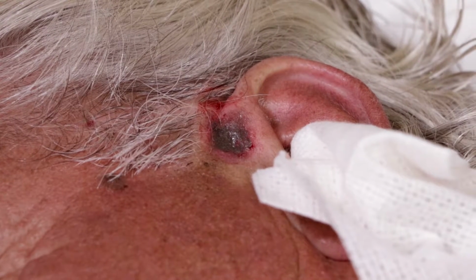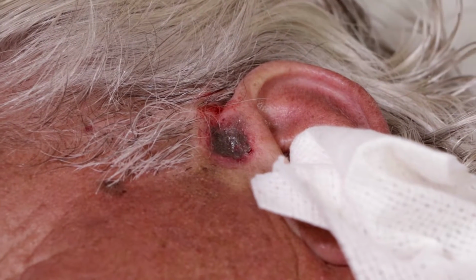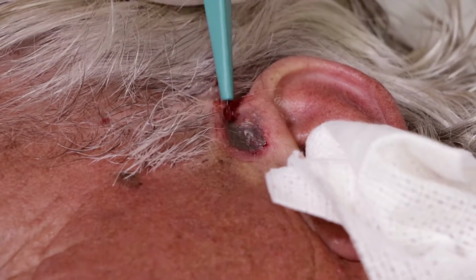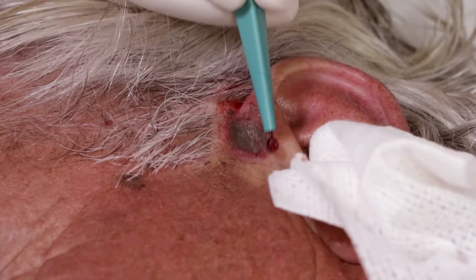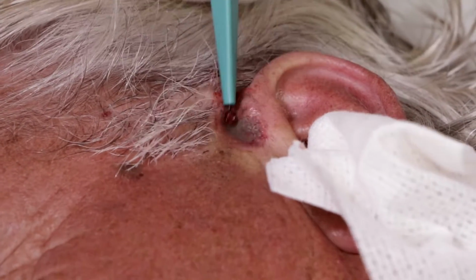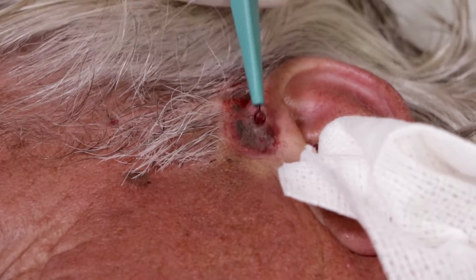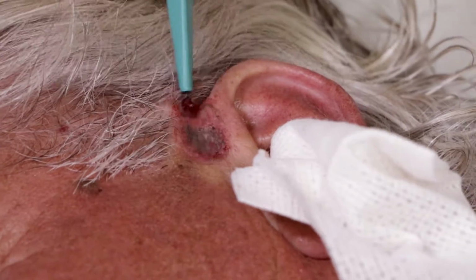with the curette and start scraping again. Why don't you just do it with one scraping? Because it gets too bloody. I actually don't know the reason that the standard is to do several, to go back and do it 3 times.